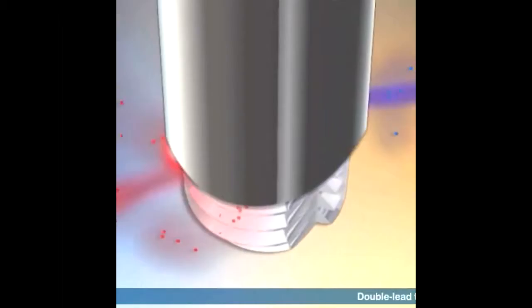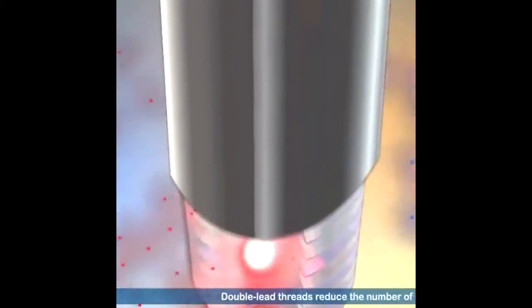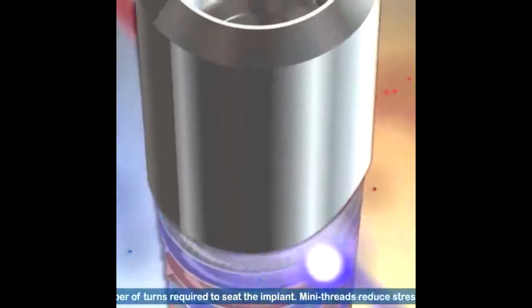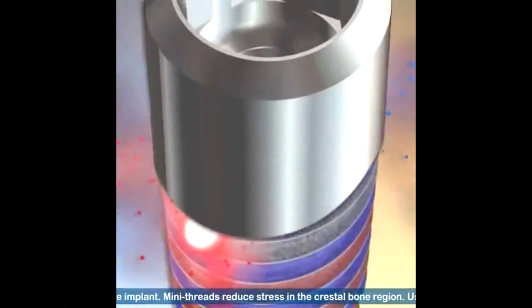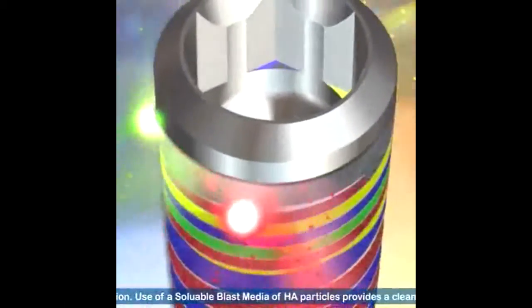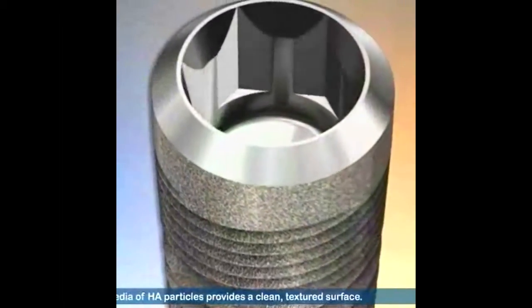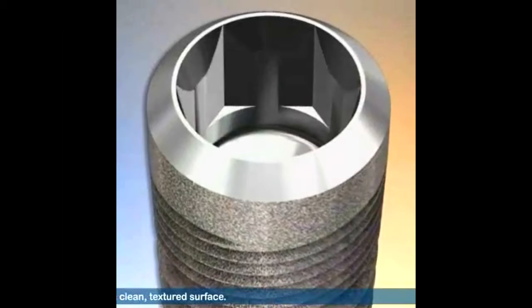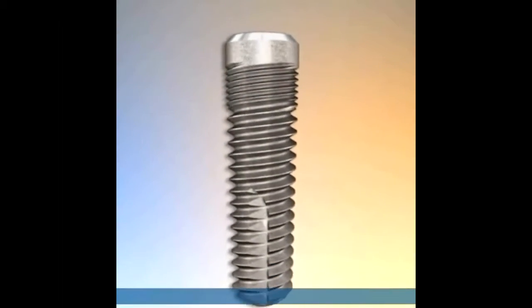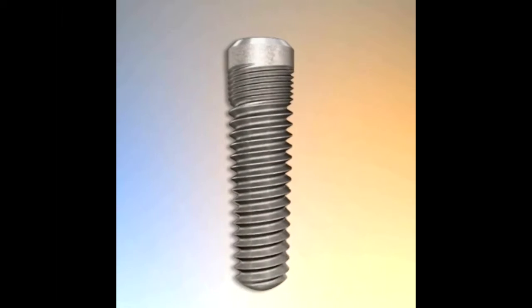So it's double lead threads at the bottom, represented by blue and red as it spins around. They look like the threads are 0.6 of a millimeter apart, but they're really 1.2. When you get into the neck area, the top 2.5 millimeters, it goes to 4 threads starting every 90 degrees. This is a screw plant with an external bevel and a long internal hex.